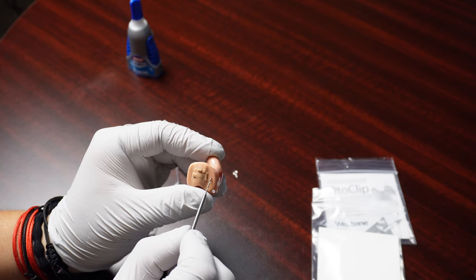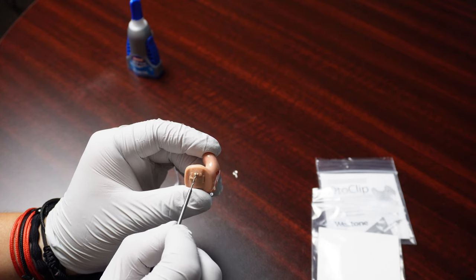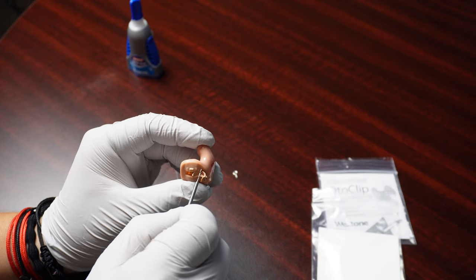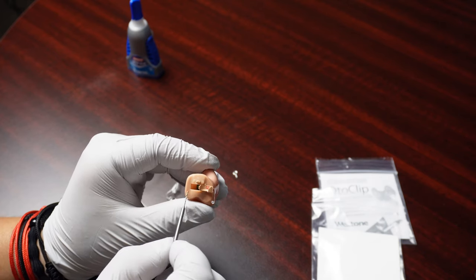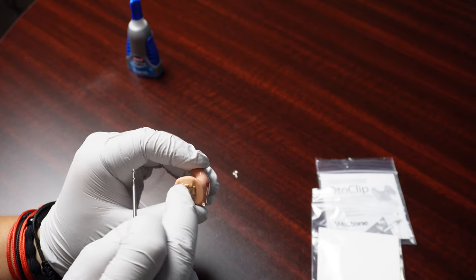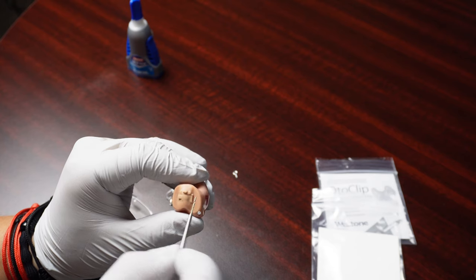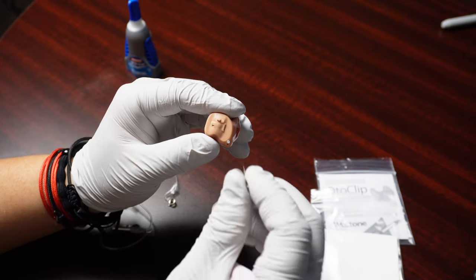Do not drill the hole next to the battery door. Do not drill the hole next to the program button. Don't drill the hole next to any microphones. And don't drill the hole over here where there's no room. Drill the hole next to the vent. This is where you want to put the hole, underneath the battery door and kind of close to the vent.